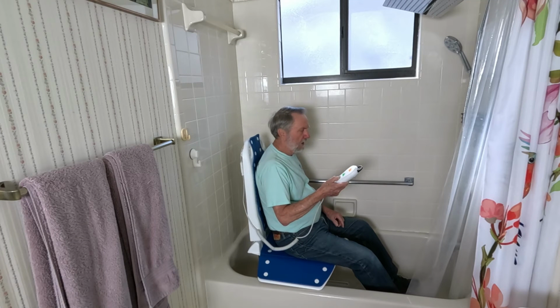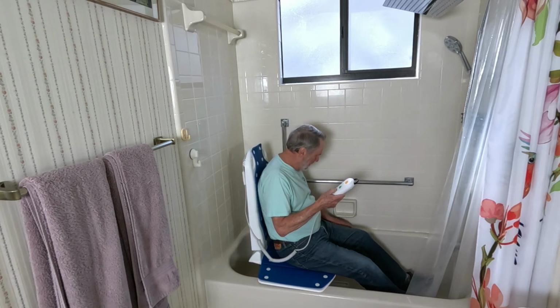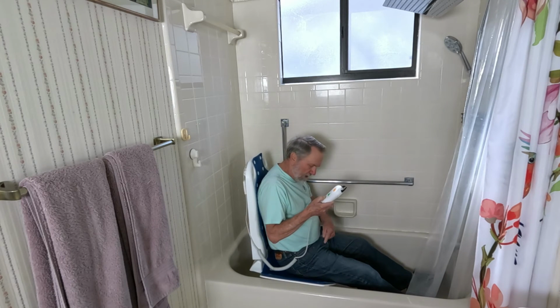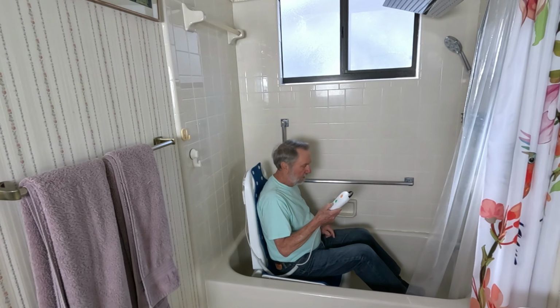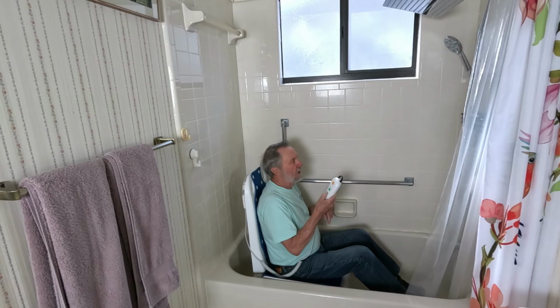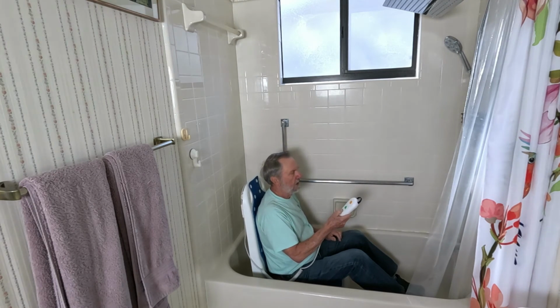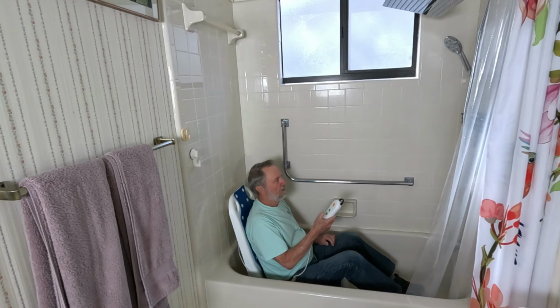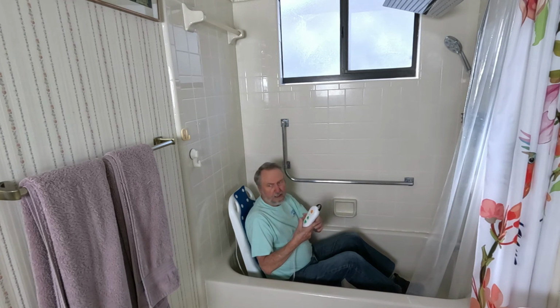And I adjust my legs. I wash. Now see, this is hitting the edge, but it's just coming right up, and it will just ride right down on either side. And when I get to the lowest position on the seat, the back is going to start going, and I let go when I feel it go back. Right there. I felt it go back, and that's as far as I can go.